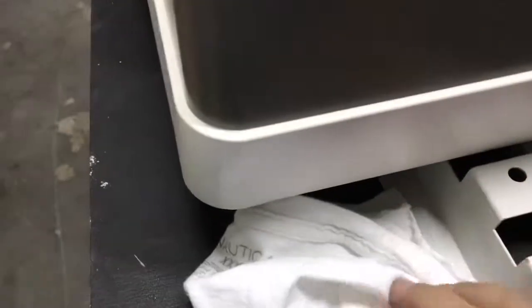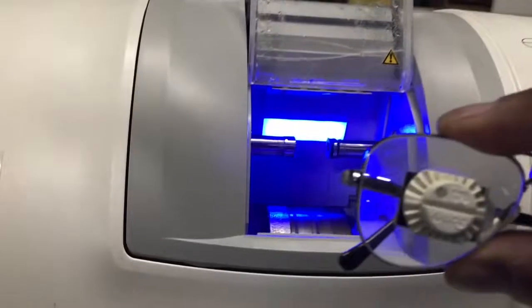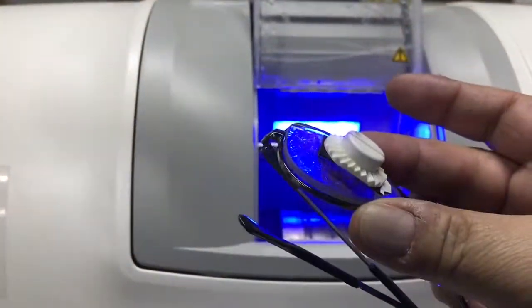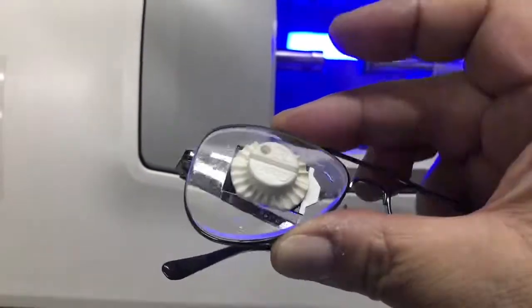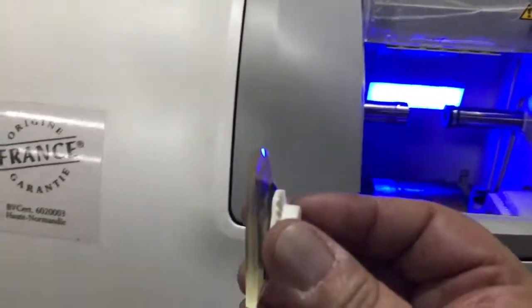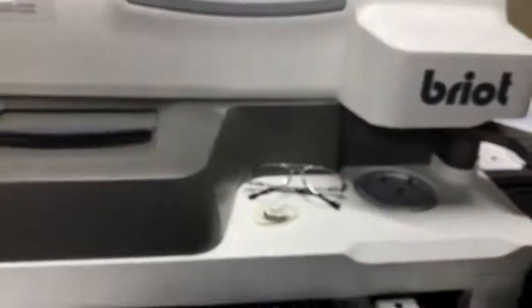It's ready. We open the chuck — I will try to do this with one hand. It's ready, just open the frame a little bit and it's done. It's a good bevel, good precision. The machine is in perfect condition.